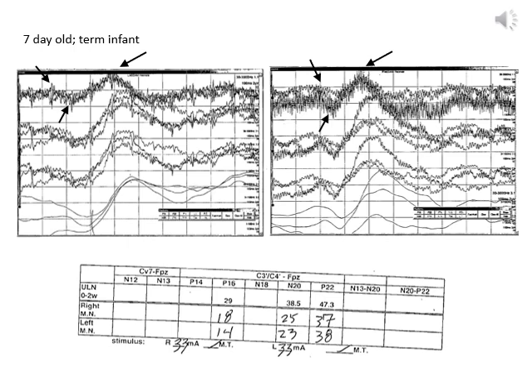The 4 tracings in each of these panels are recordings at 4 different bandwidths. The top tracing is the bandwidth that's used within the guidelines. The other bandwidths are narrower and cut out a lot of the noise. And so you can see that the tracings look more and more smooth. But when we cut out the noise using these kinds of filters, it changes the latencies of the responses. And so if you're using the 4th tracing to identify the peaks, it's nice to try to track up to the first tracing to see if you can find the same peak and to use the latency from the first tracing, as that is more accurate.